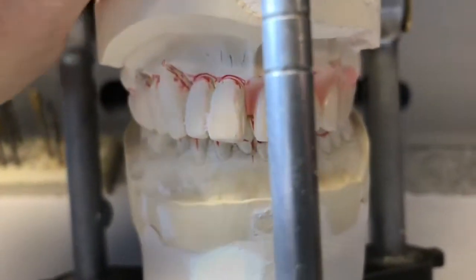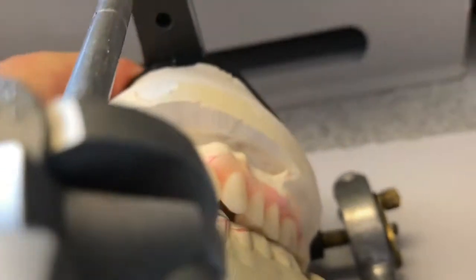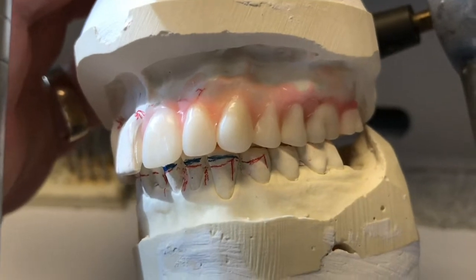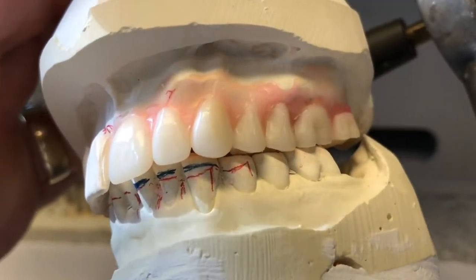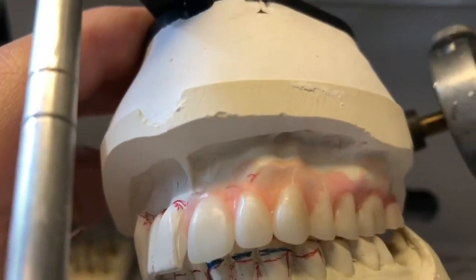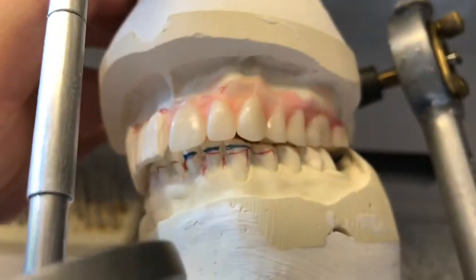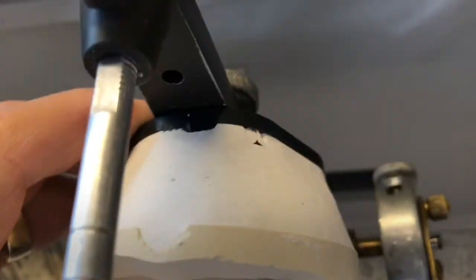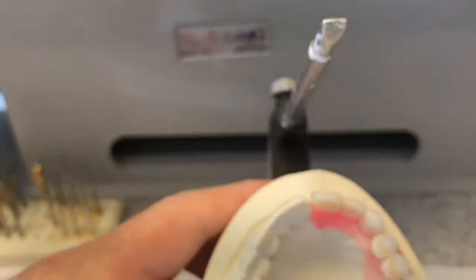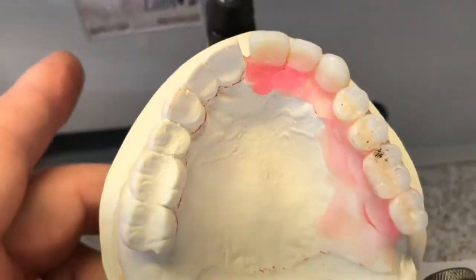What I've done is set half of it by surgerizing the cast — grinding off the teeth and not taking away any more bone than the teeth, since in this case there are no big undercuts in the ridge. We've got some small ones. I've basically ground the teeth off the cast on this half of the arch, keeping the adjacent central so that I know how far facially to place the teeth and the incisal length.